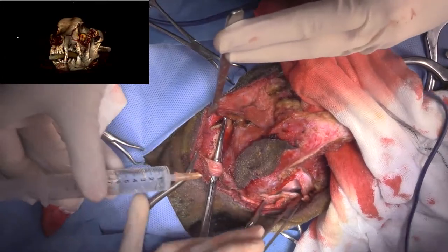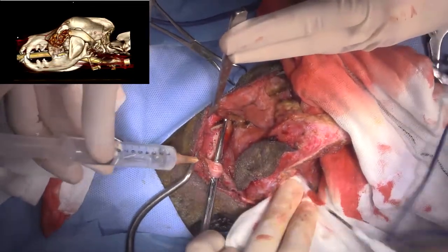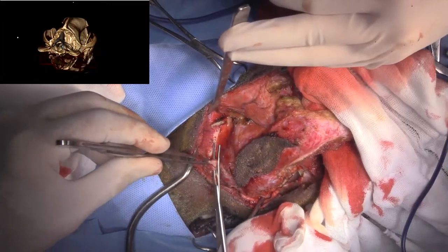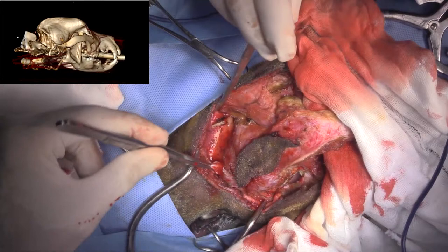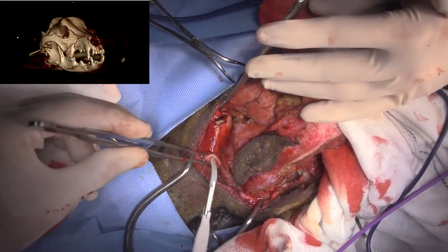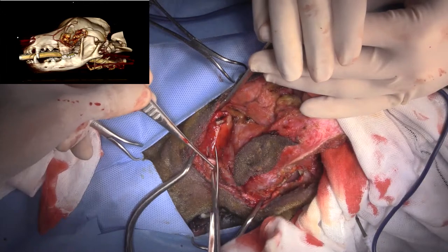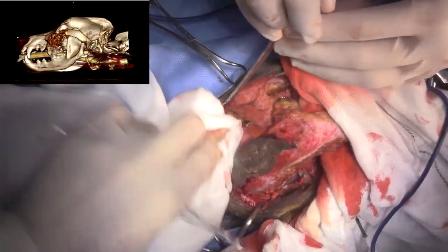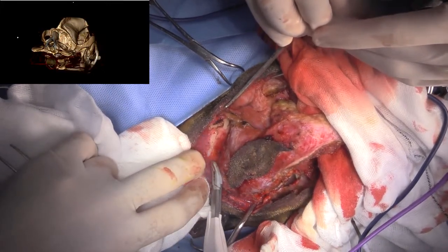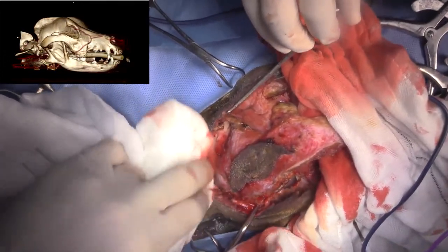Sure, if you guys can see the teeth there. So Jeff is just injecting into the infraorbital nerve before we cut it. Go ahead and transect that. We don't have any choice. Coming out, I don't mind cauterizing it. Alrighty.